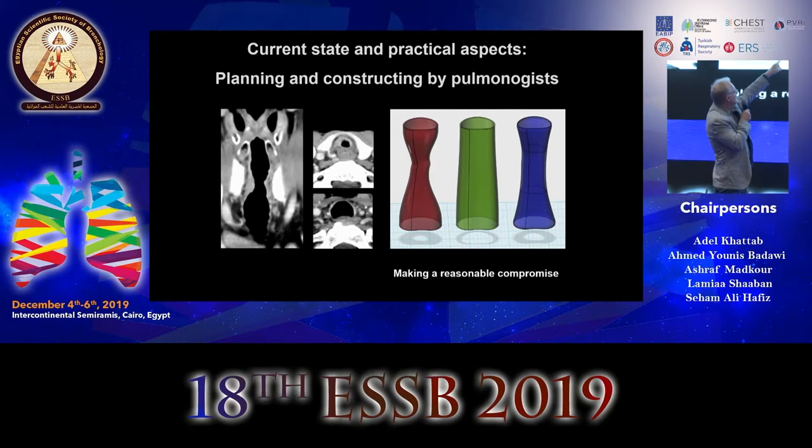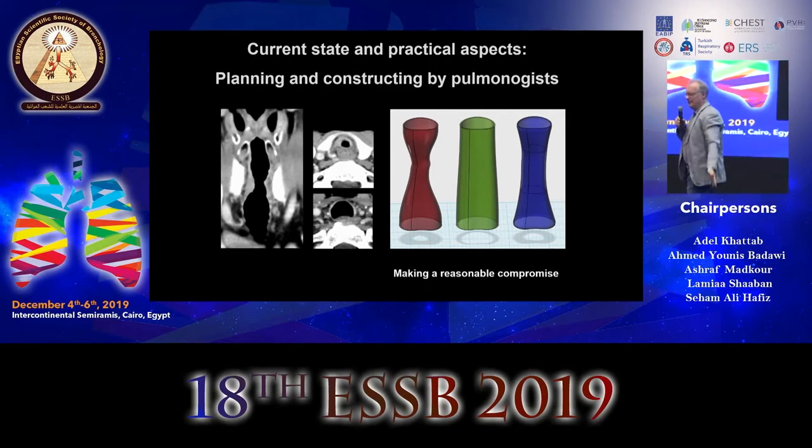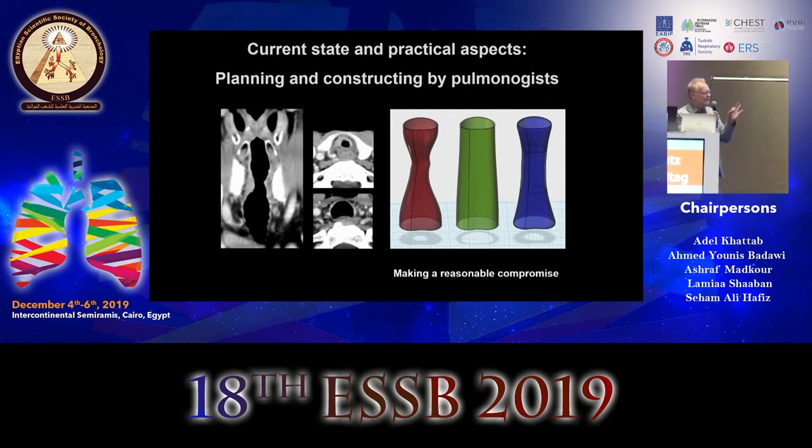You will never get that into a stenosis. If you put that in, it will not help the patient. So we as pulmonologists have to decide how it should look and make a reasonable compromise. That's why you cannot simply send the data to a company expecting them to send the perfect stent. We have to tell them, okay, I want some expansion force here, slightly smaller there.